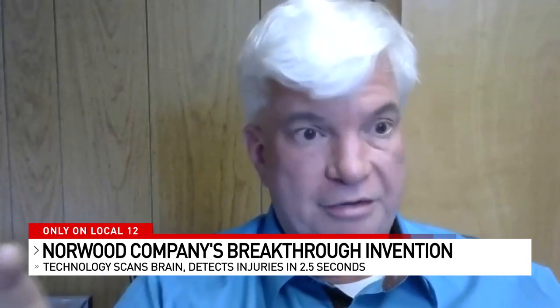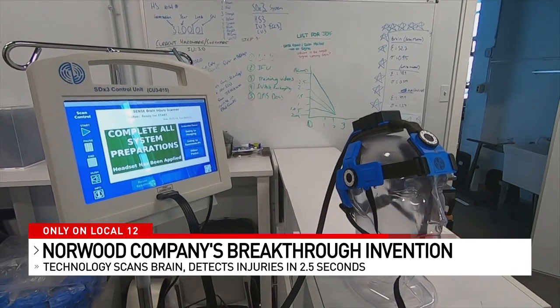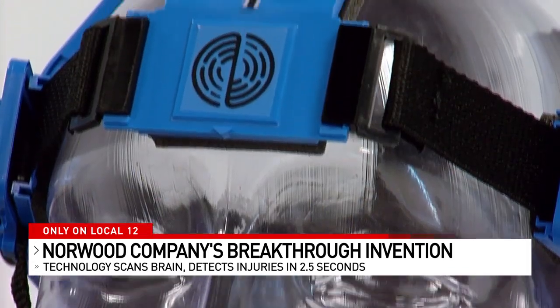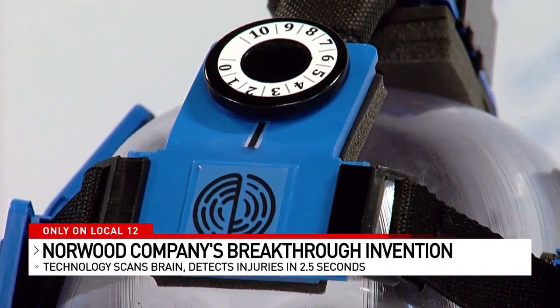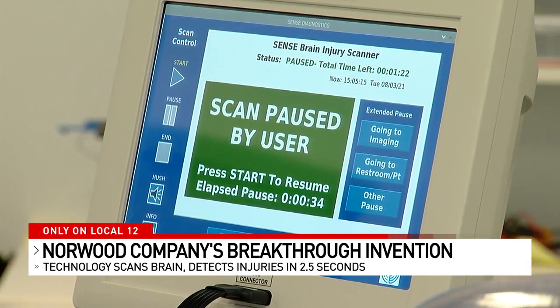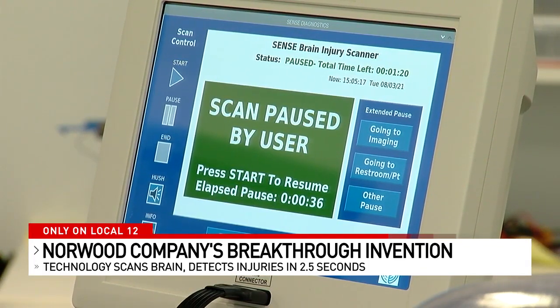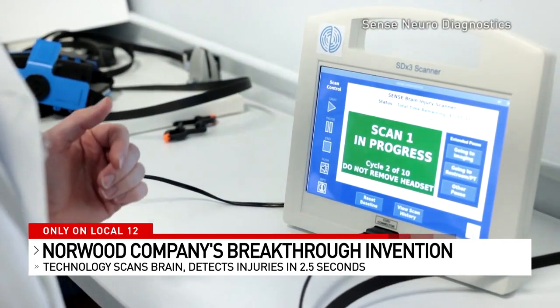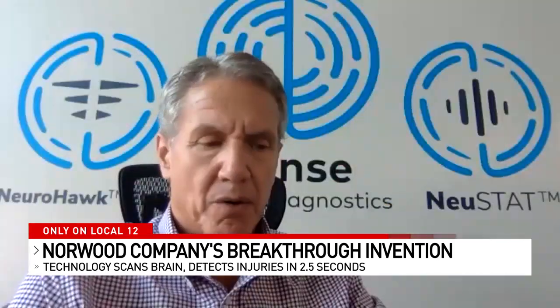Small trial, but very promising data, but pilot trial, no question. There's also a study where the device identifies various types of strokes. That's important for first responders because it allows them to make the right decision on where to take the patient for treatment. It'll tell them if it's a stroke and potentially which type of stroke it is. So all they really need to know is how to turn it on and read the result.